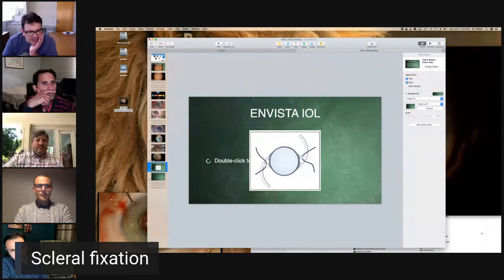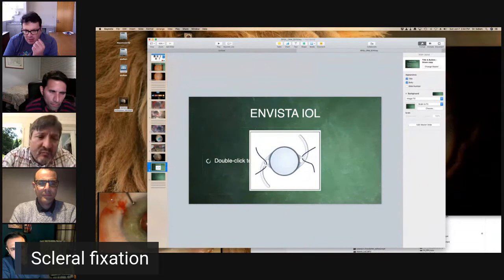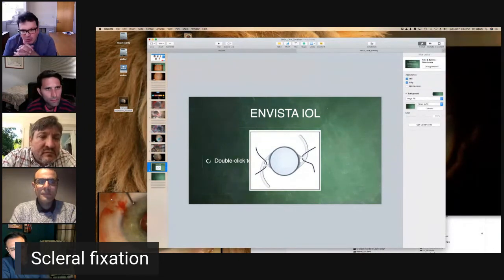So again, we discussed this for completion, really. So maybe the audience can look that up and see. But the worry is, as Chris said, with all these acrylic lenses, and also from my side, I think it's still a 2-point fixation. But it's a hydrophobic lens.